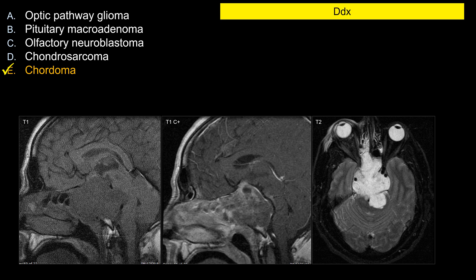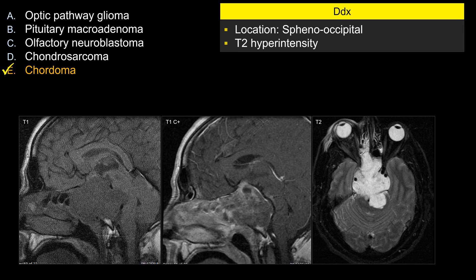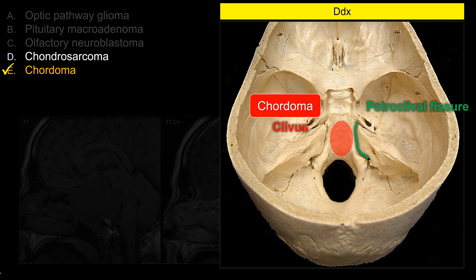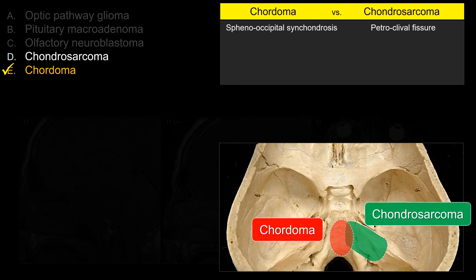The differential diagnosis in the sphenooccipital region — the central skull base with T2 hyperintensity — basically comes down to two things: chordoma versus chondrosarcoma. Both occur in around the same location and are relatively bright on T2-weighted sequence. The clivus is in the midline, while the petroclival fissure is off midline. Chordoma, derived from notochordal remnants within the sphenooccipital synchondrosis, tends to be midline. Chondrosarcoma is derived from the petroclival fissure, so it tends to be eccentric. For board exam purposes: chordoma is a midline lesion and chondrosarcoma is off midline.